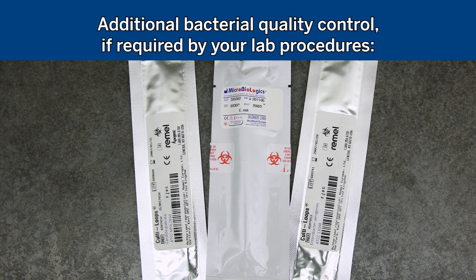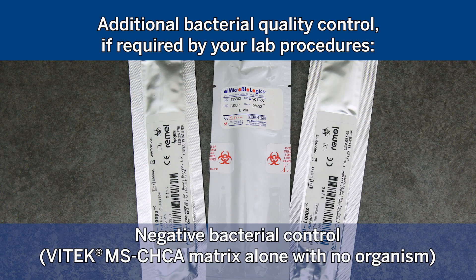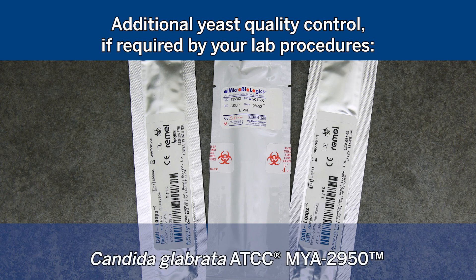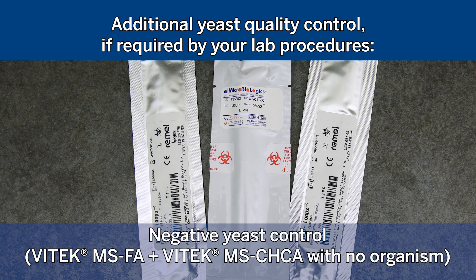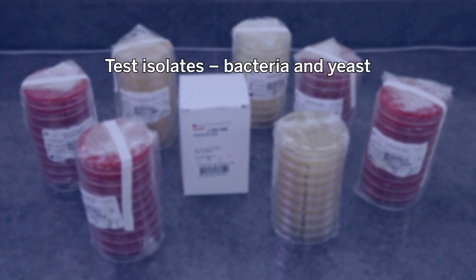Additional bacterial quality control, if required by your lab procedures: negative bacterial control is Vitec MS-CHCA matrix alone with no organism. Additional yeast quality control, if required by your lab procedures: Candida glabrata ATCC MYA 2950. Negative yeast control is Vitec MS-FA plus Vitec MS-CHCA with no organism. Test isolates include bacteria and yeast.